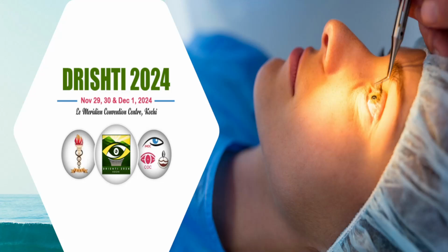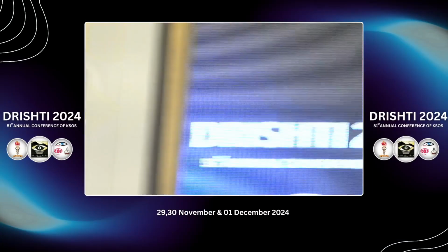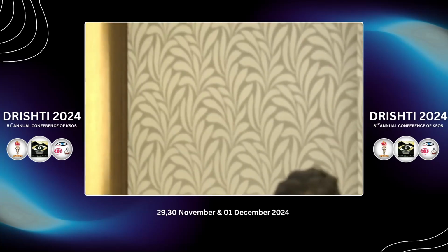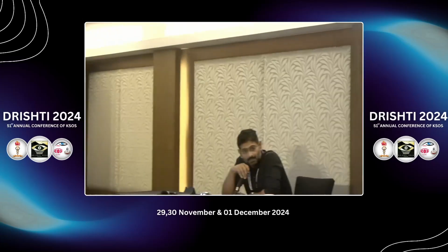Everyone. We'll be talking about OCTA. OCTA is a non-invasive, rapidly evolving technology that has shown to be valuable in the diagnosis and follow-up of various ophthalmic pathologies. It is still not considered a must-have with the current knowledge that we have, but with newer findings, things remain elusive in the future. So this instruction course will dwell into the basics and we'll try to pick up some diagnostic clues in various ocular pathologies.